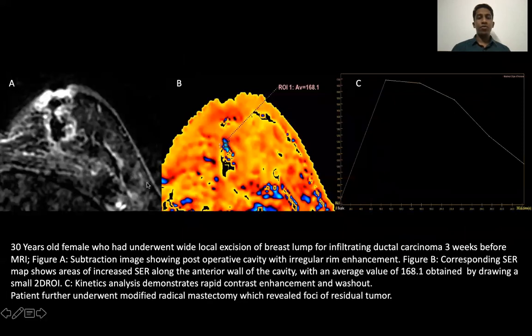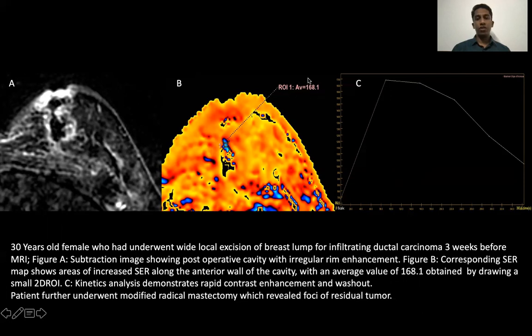Case 4: A 30-year-old female who had undergone wide local excision for infiltrating ductal carcinoma. The subtraction image shows a postoperative cavity with irregular thick rim enhancement. The corresponding SER map shows areas of increased SER indicated by the blue region along the anterior rim of the postoperative cavity. A small 2D ROI drawn here reveals a high absolute SER value of 168, and the corresponding kinetic analysis shows washout kinetics. The patient underwent modified radical mastectomy, which revealed foci of residual tumor along the anterior margin of the postoperative cavity.